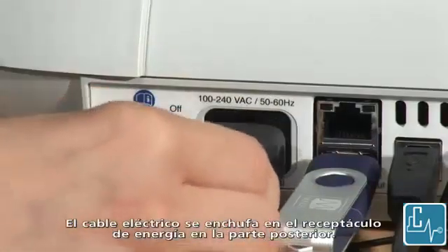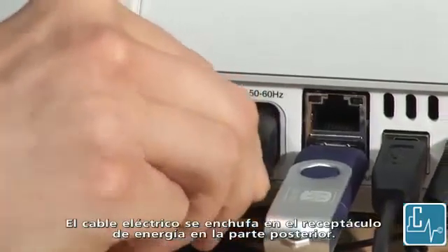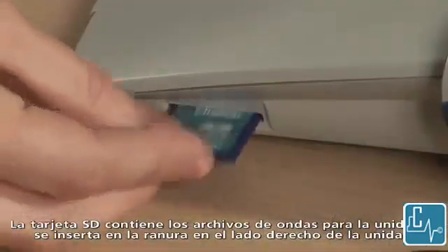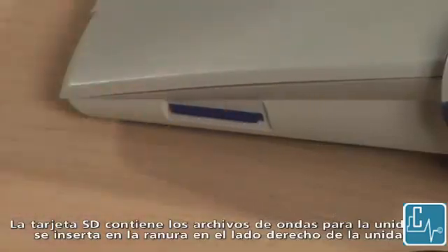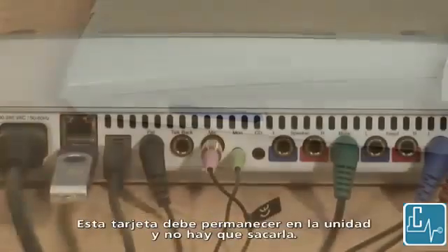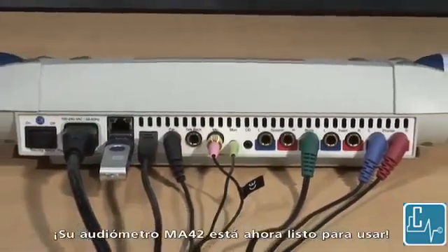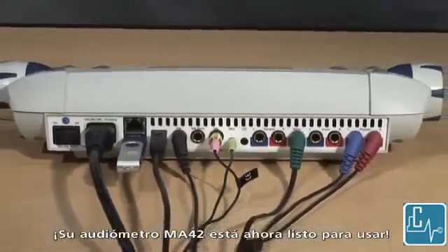The power cord is plugged into the power outlet on the back. The SD card contains the WAV files for the unit and this gets inserted into the slot on the right side of the unit. This card should stay in the unit and does not need to be removed. Your MA42 audiometer is now ready to use.